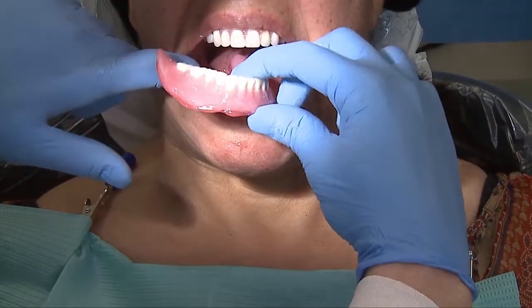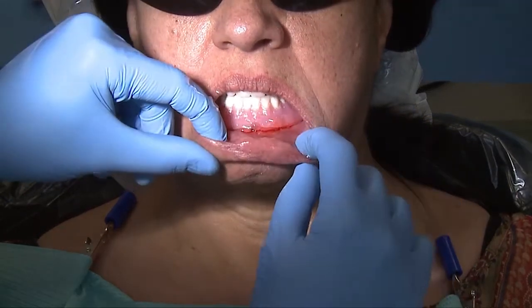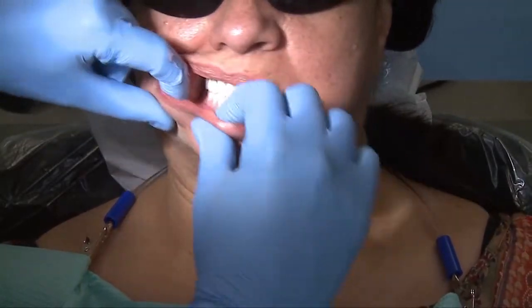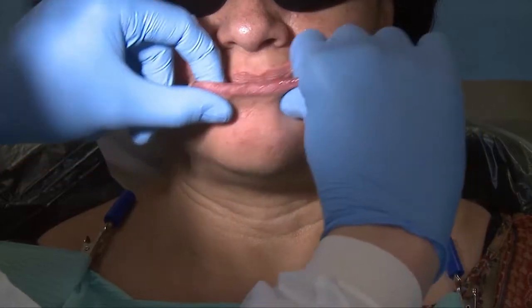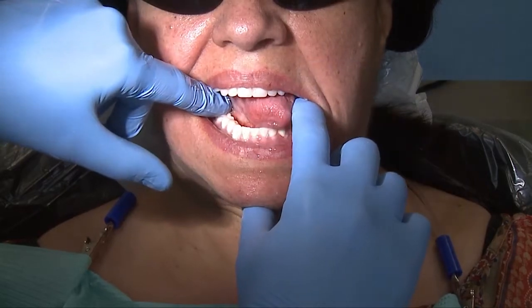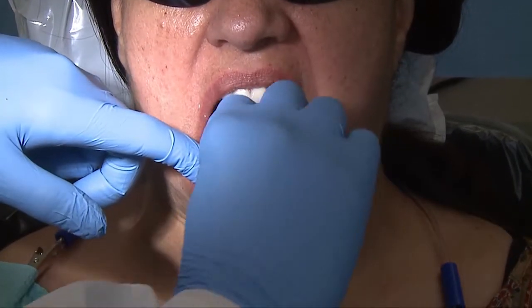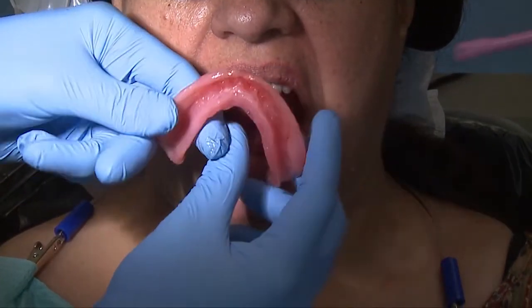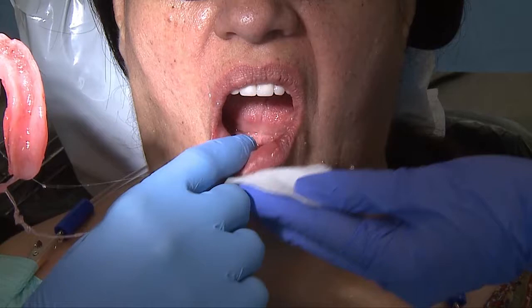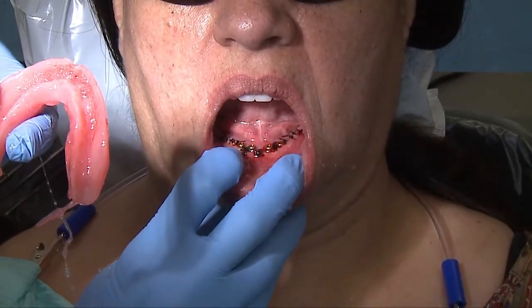As we place it in the mouth, we just have the patient open and gently close her jaw. As she gently closes, we're going to do some gentle border motions, getting that to seal in nicely — left and right. Go ahead and close. Open for me. Very gently pulling it straight up. You'll notice I got a very nice final soft liner appearance. Because I was careful with my abutments, I did not pull out any sutures or anything of that nature.